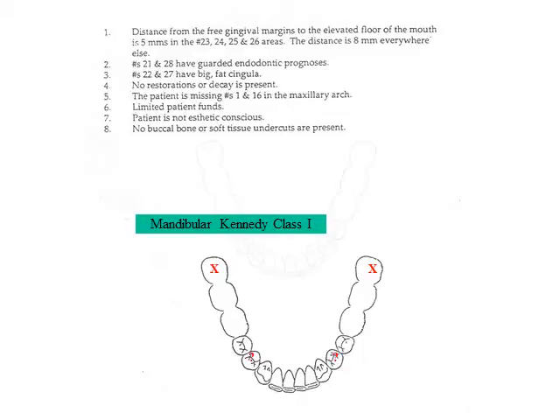Assuming an intact maxillary dentition, diagnostic casts are acquired and mounted correctly. The mandibular cast is surveyed to determine guiding planes, retentive areas, areas of interference and aesthetics, as well as the position of the height of contour.